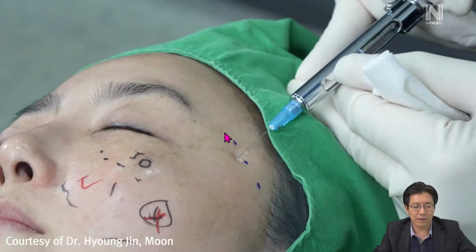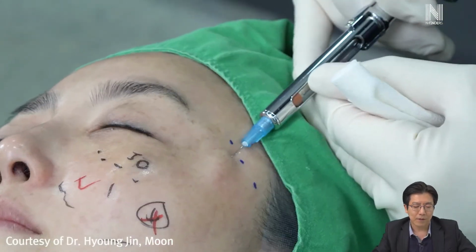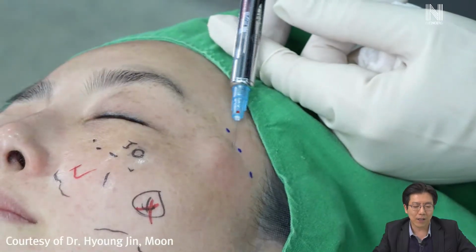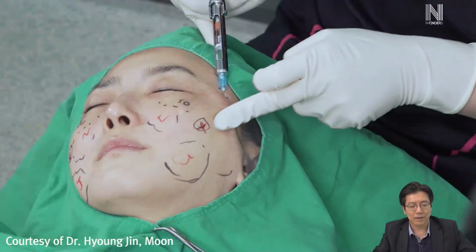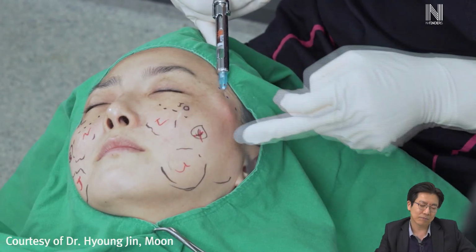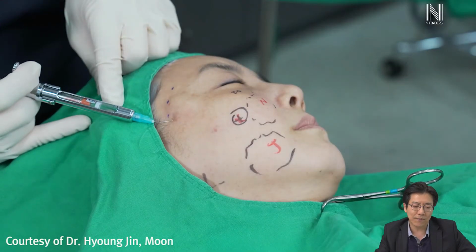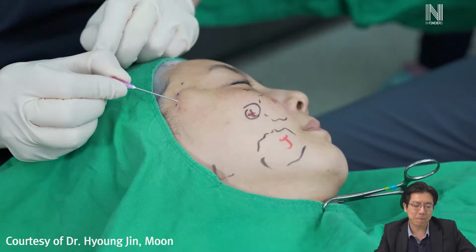I injected lidocaine with epinephrine on each side. I recommend lidocaine with epinephrine regionwide. The vasoconstriction can also make the vessel diameter smaller, so it is safer. So I recommend injecting lidocaine with epinephrine.